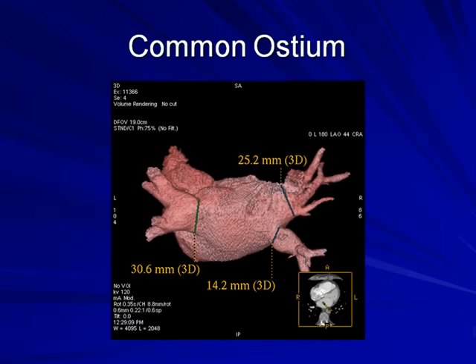Now here is a CT of a patient with what I would consider a left common pulmonary vein. We've actually measured the size of this vein. As you can see, the left superior and left inferior veins branch in a location quite distinct from the ostium of the left common. So maybe most people look at that and see that that's a left common vein. But why do you care?